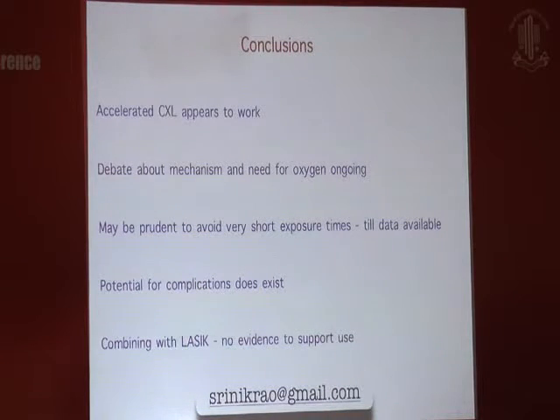So in conclusion then, I think the accelerated approach to cross-linking does appear to work. However, if you go into the basic biomechanics, and there is the debate about the mechanism of action and the need for oxygen in the stroma during the cross-linking, it may be prudent to try and not shorten the treatment time excessively at this point in time, but rather to wait for more evidence.